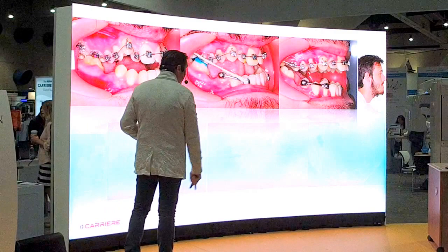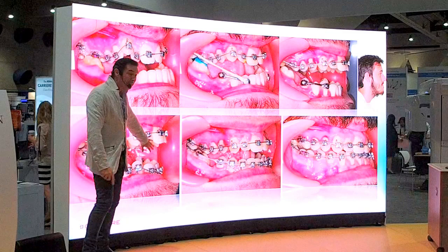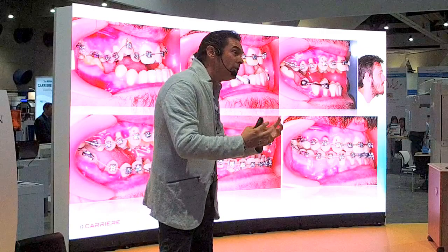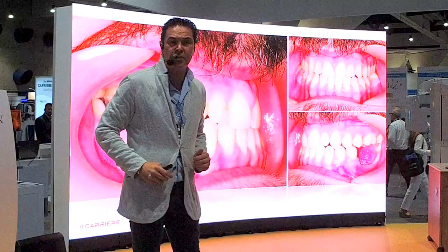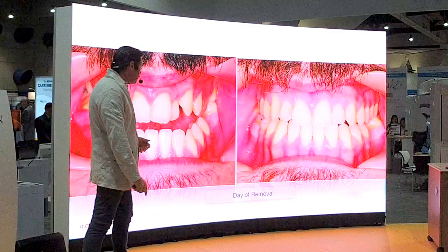Now the case is suitable to switch to the next stage — removing the motion and starting to place the brackets. Now it's time to place the brackets. We can see a nice open bite, but we train the tongue — placing the tongue correctly — because the tongue is the major problem in open bites. We have to talk with the patient about the tongue and the importance of correct tongue positioning for swallowing. We end up the case with a nice and correct bite. But the most important thing is not what we can do dentally — it is whether, with this counterclockwise change of the occlusal plane and this new relation between mandible and maxilla, we enhance the face.